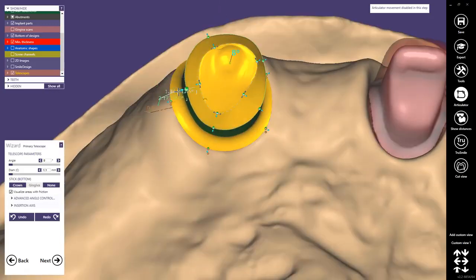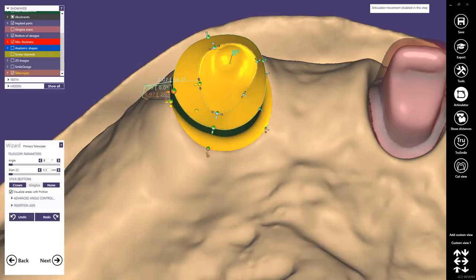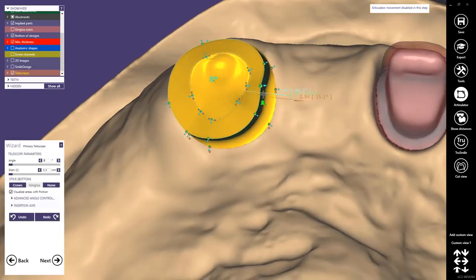and then I start creating. I move, panic button, then I move this out, I add a point here to create here this kind of flat area, because here we will later on add the attachment. And here I will also add a point because later we will create here this kind of interlock.